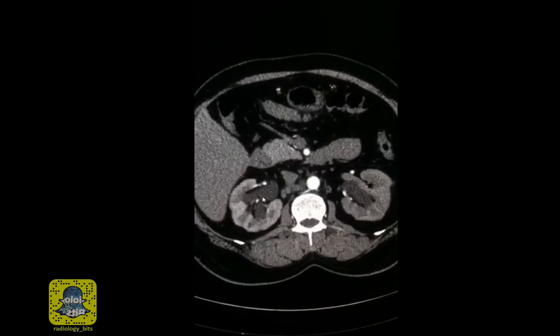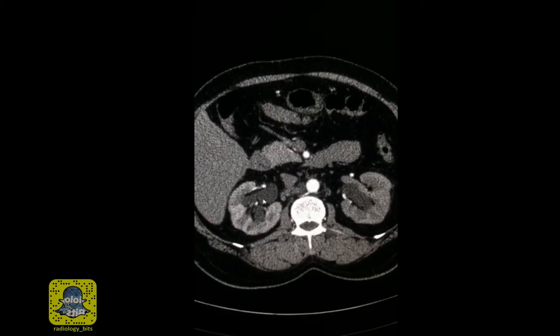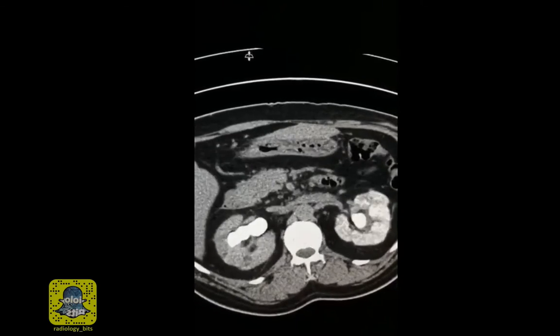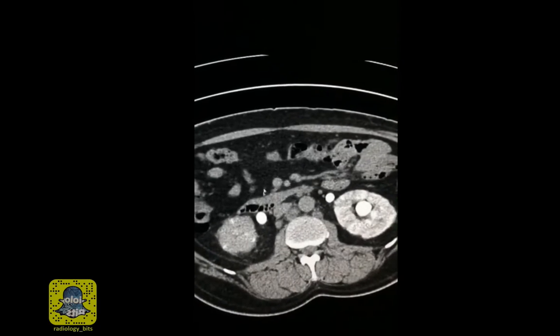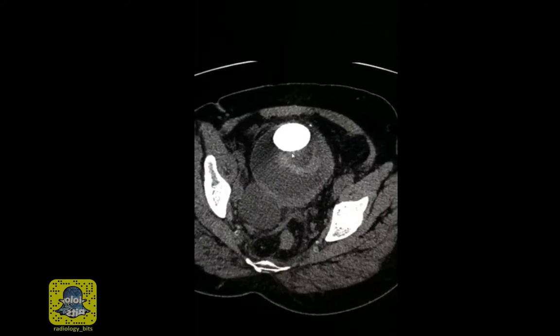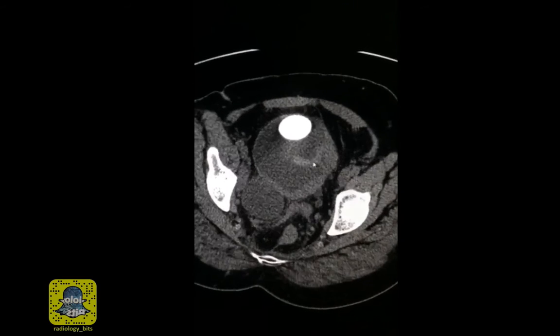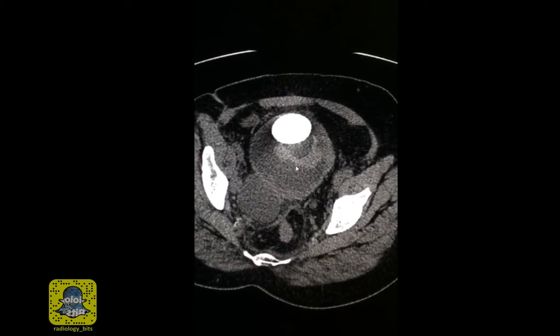In earlier phases, such as the arterial or portovenous phase, the renal collecting system is not filled with contrast, and that's why it's useful to do a delayed acquisition after a few minutes to see filling of the renal collecting system and make sure you don't have filling defects. We also revised the CT fact of acute hematomas and blood clots being slightly hyperdense even without giving contrast.